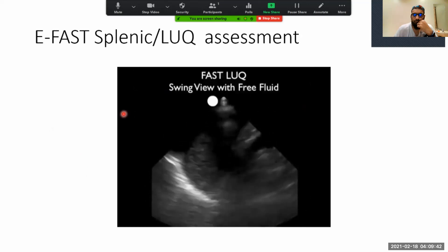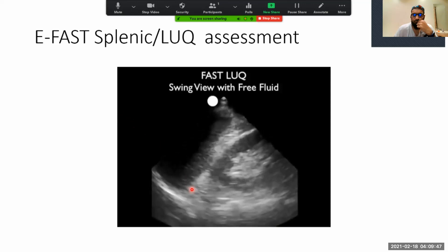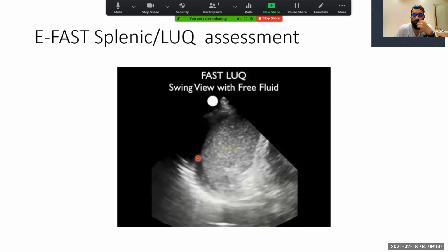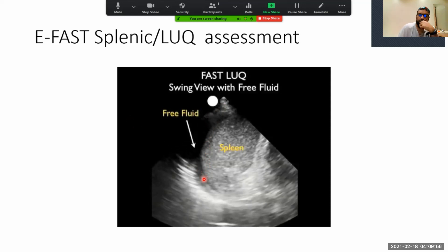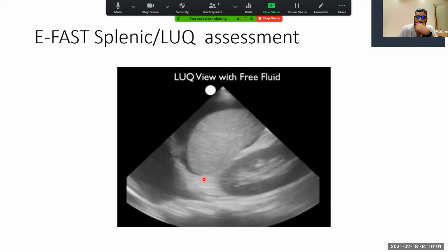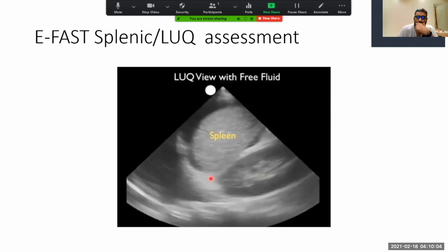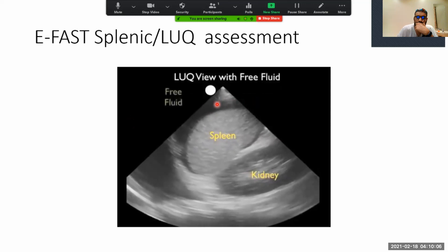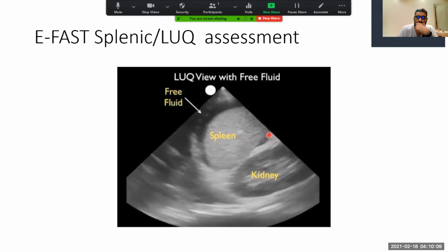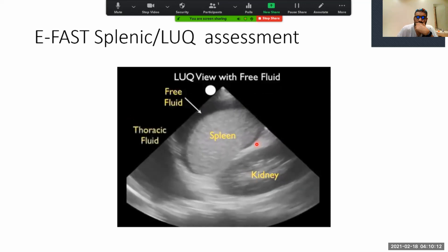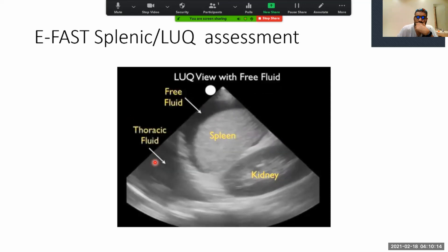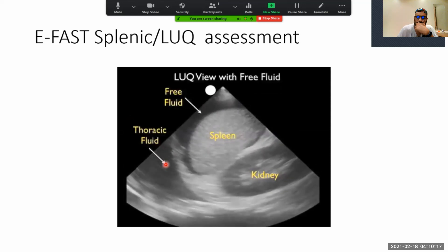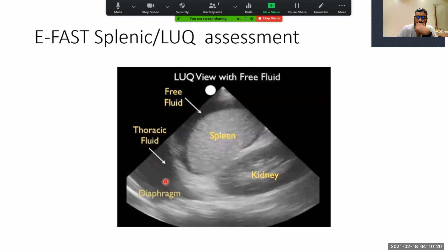Here's another positive examination in a patient who comes in hypotensive after being hit by a car. I'm swinging the probe between the kidney and superiorly to look at the spleen. Notice the absence of fluid between the spleen and the kidney, but the presence of free fluid right above the spleen and below the diaphragm — indicated by that dark stripe. Here's an interesting video clip from another trauma patient — we delineate the spleen and kidney, and notice the presence of fresh fluid as a dark or anechoic stripe layering out superior and anterior to the spleen.